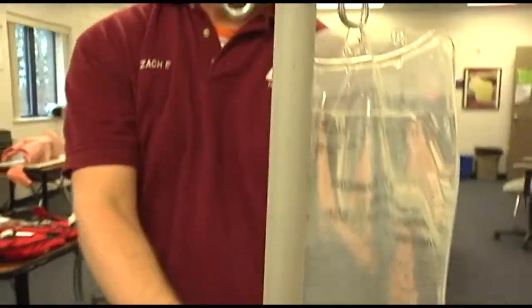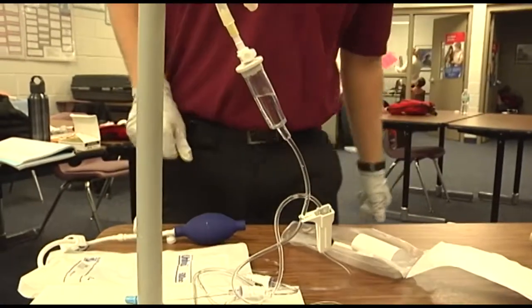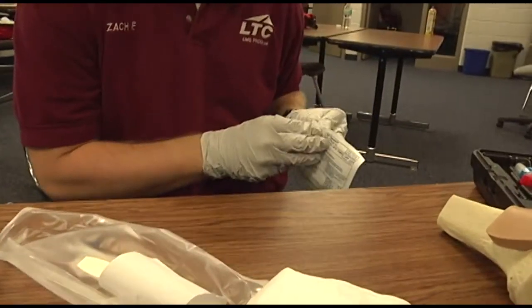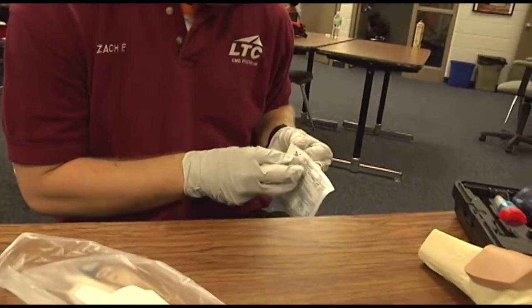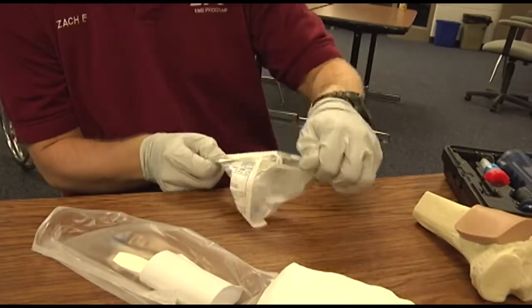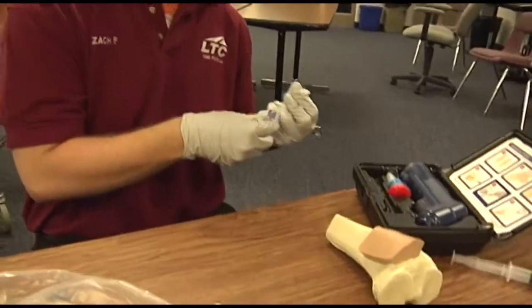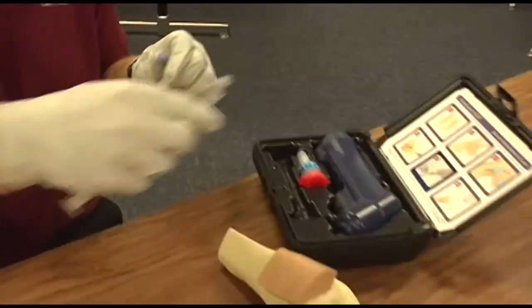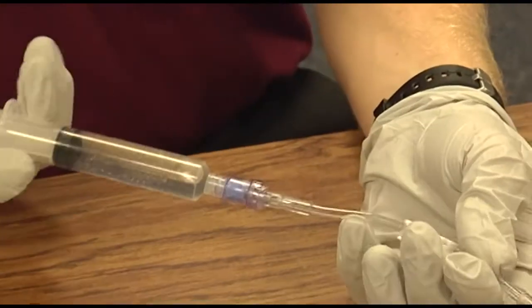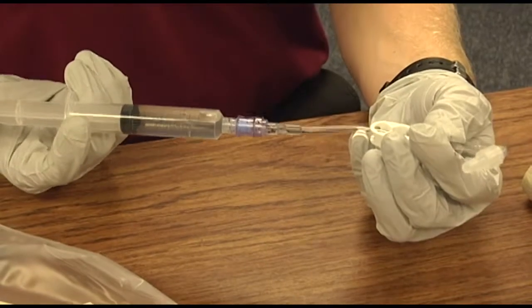At this time, you could prepare and flush the extension tubing. That syringe will screw right to the blue end, and just slowly flush — saline just drips out the end. That would confirm it's all properly done.